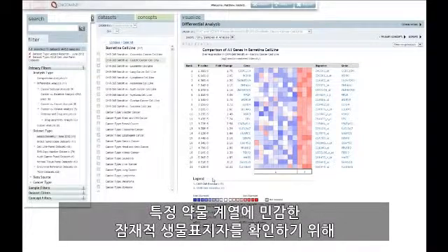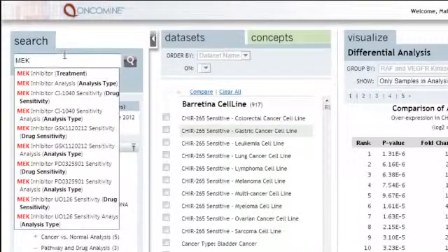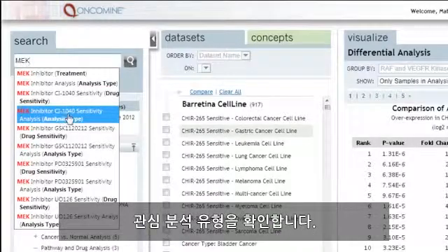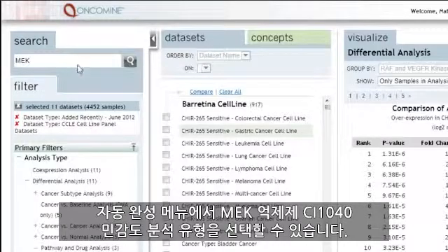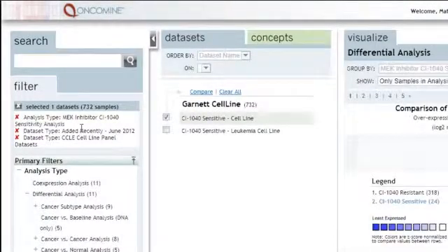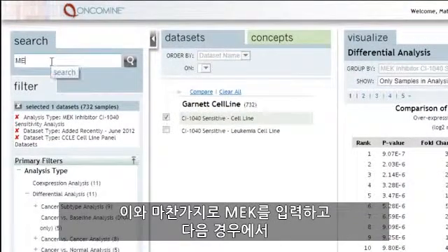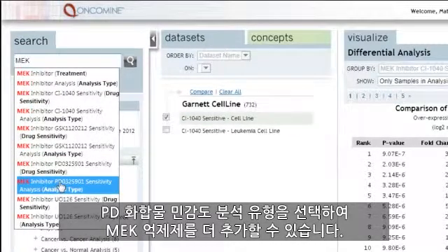In order to identify potential biomarkers of sensitivity to a particular drug class, searching on the target name or drug name will return options to select specific analyses. To choose MEK inhibitors, type MEK into the search box and identify the analysis type of interest. MEK inhibitor CI1040 sensitivity analysis type can be selected from the auto-complete menu. With this analysis type added to your filters, you will then observe the specific analyses for that drug. We can add additional MEK inhibitors in the same manner by typing MEK and selecting the PD compound sensitivity analysis type.